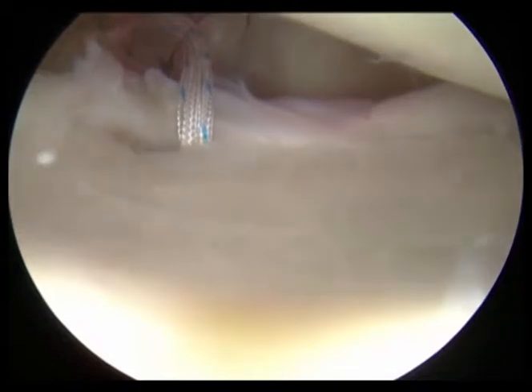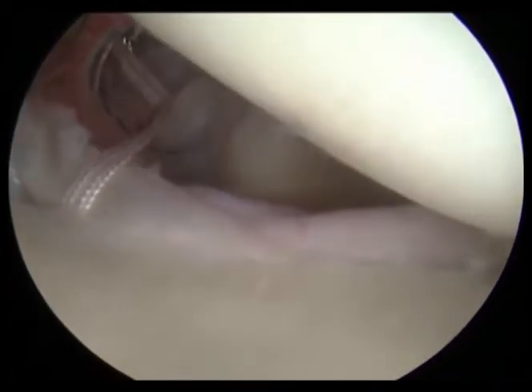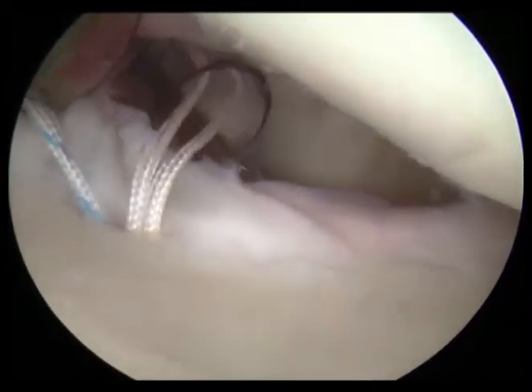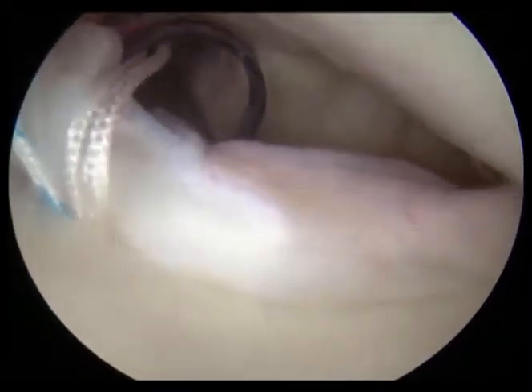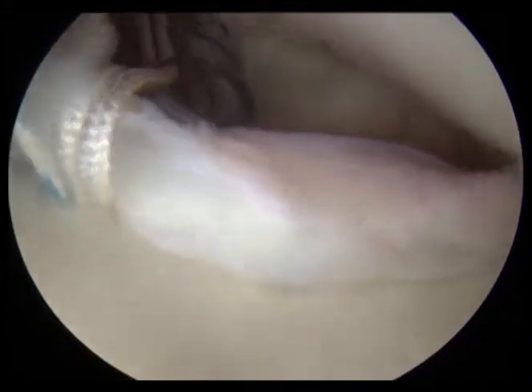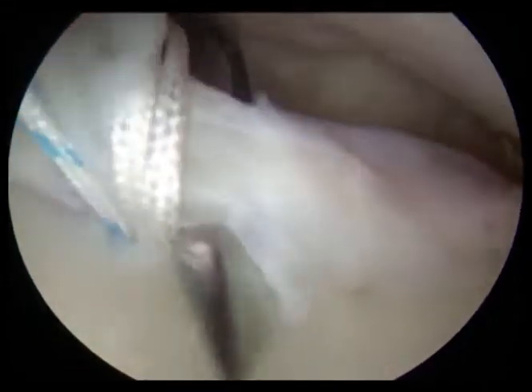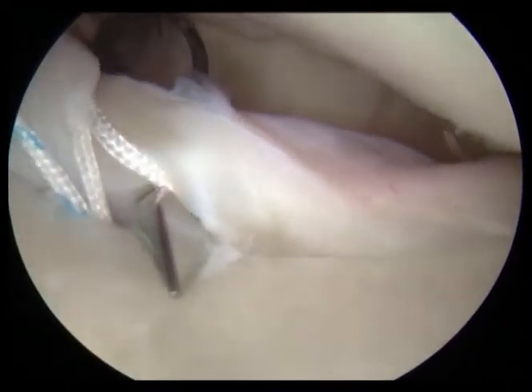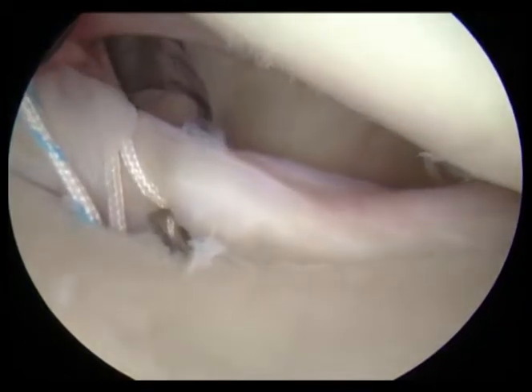You can see our sutures here, and we're going to use the tissue perforator again to pass the suture through the labrum. That allows us to secure this soft tissue up against the bony interface — this is called a bird beak suture passer. We're able to grab the suture and manipulate it all through the scope and tie our knots arthroscopically.